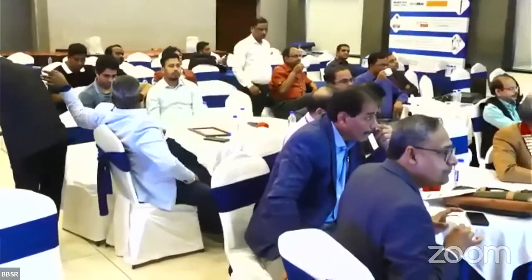Bone defect usually occurs on the tibial side, but it can occur also on the femoral side, sometimes on the patellar side also. It can be contained when there is an intact peripheral rim, which will help in future support to the base plate. It may be non-contained when there is no intact peripheral rim. In that case, you need to reconstruct your bone defect with various gadgets and tools.